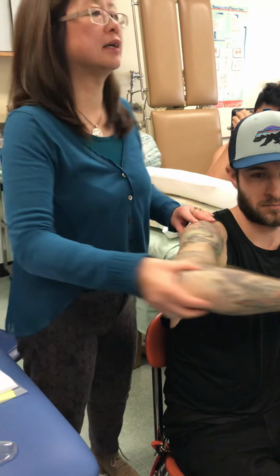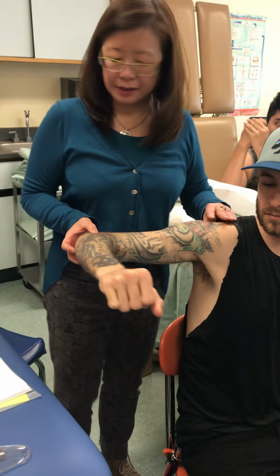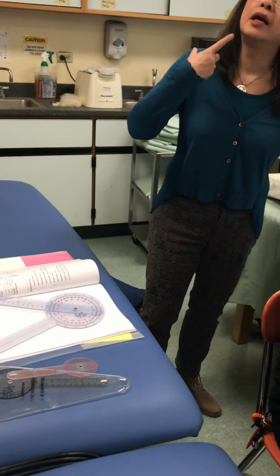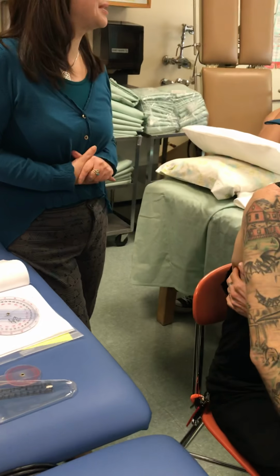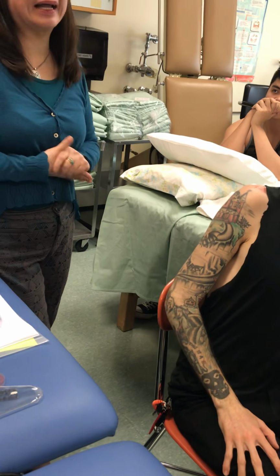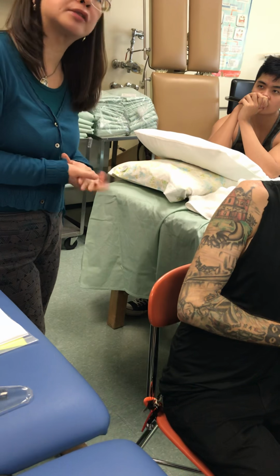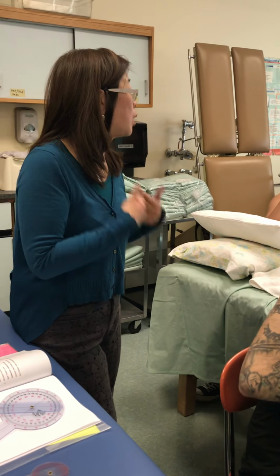There are people in the clinic that will just start in this position and take a measurement this way and this way. That's why in the book I gave you some variables in the numbers. Because in the clinic, you will see it that way, and you go, oh, that's not what Professor Tom said. Why are you starting it there? Because in the clinic, in the long run, it may not make a huge difference, as long as they're consistent with the measurement of where their starting position is. So you need to be aware of what they're starting with.